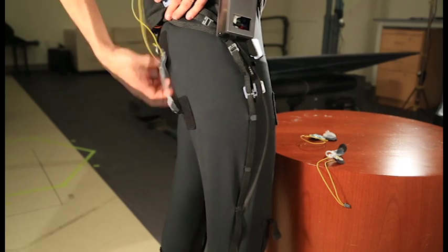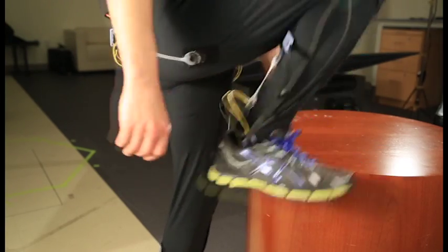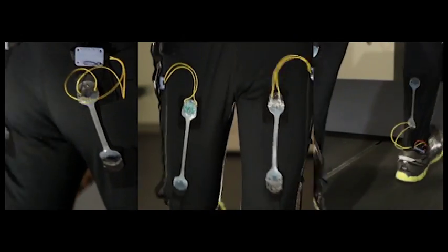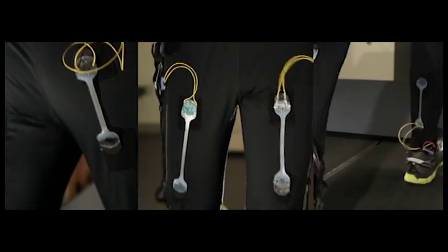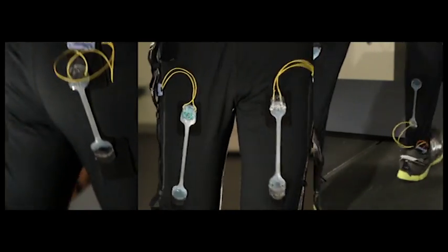The sensors are easily attached to the garment with appropriate anchor points and stretchable wiring. Motions of the joints are detected as strain on the surface of the garment, and sensors are placed at lines of maximal extension to increase sensitivity.